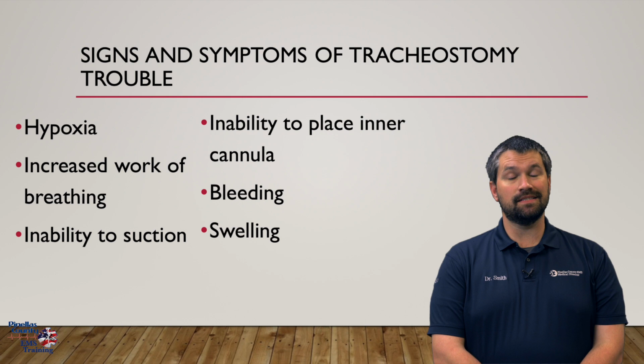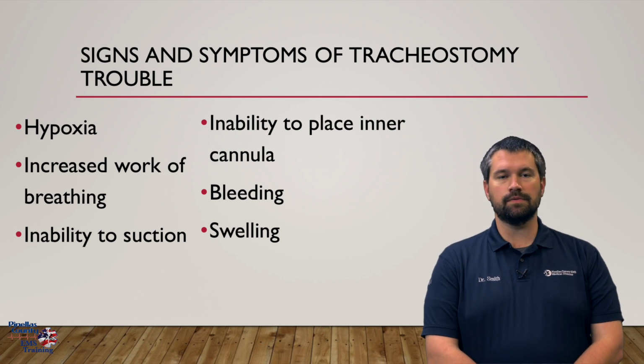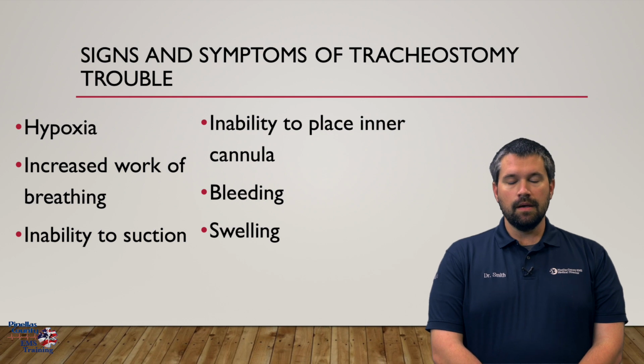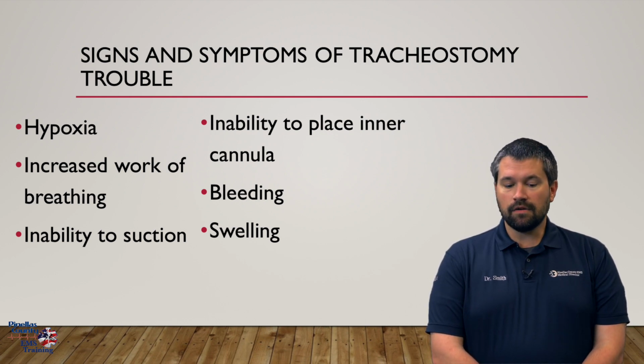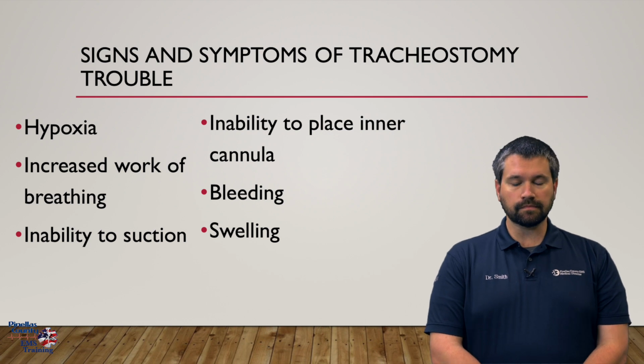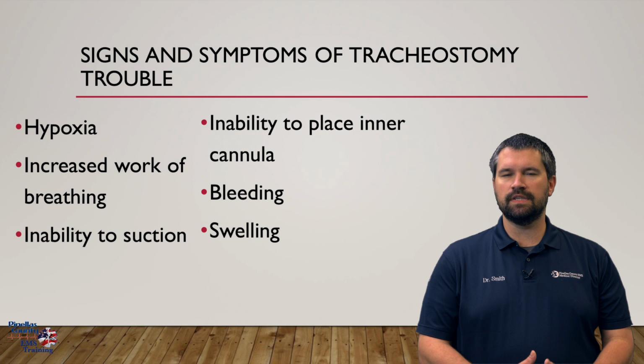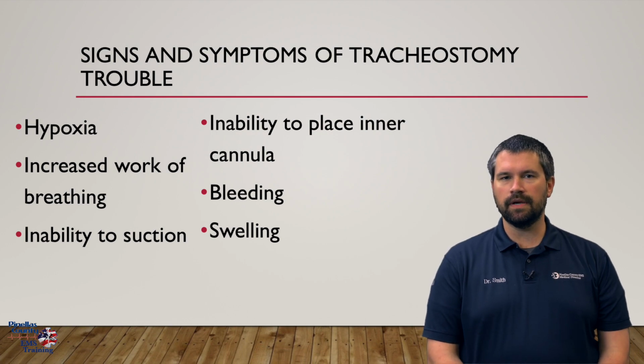Oftentimes it's the same signs and symptoms that we see for any of our respiratory patients. Hypoxia, increased work of breathing. Maybe if you are assessing the tracheostomy itself, you're unable to suction it out, you can't place the inner cannula. Perhaps you notice some bleeding or swelling around the site. Those are the most common signs and symptoms that we'll see with our tracheostomy patients.